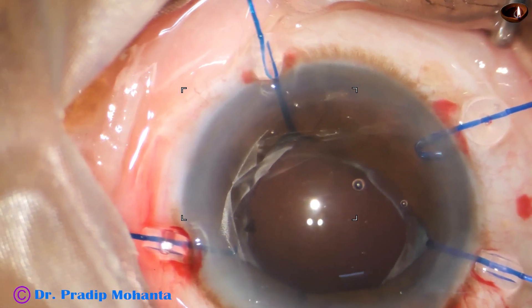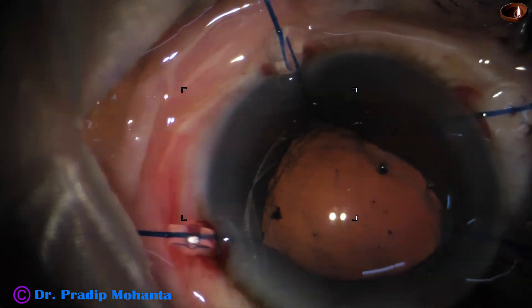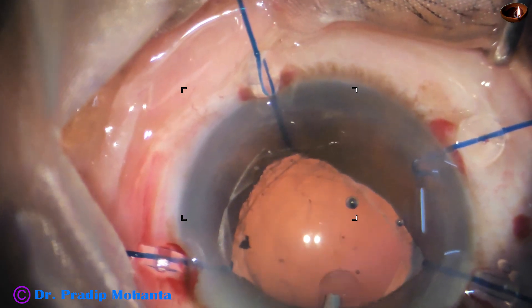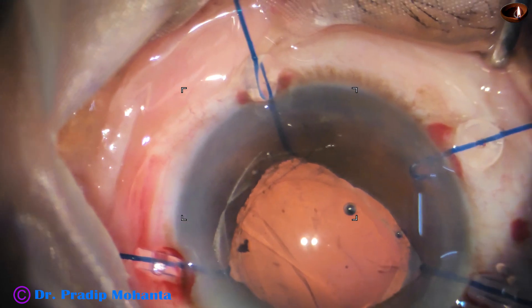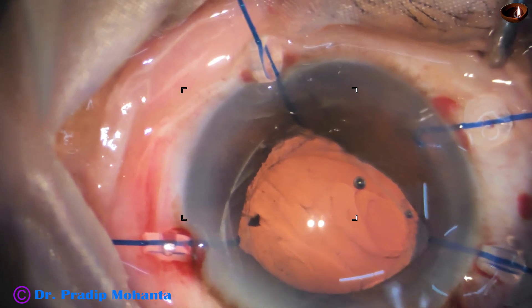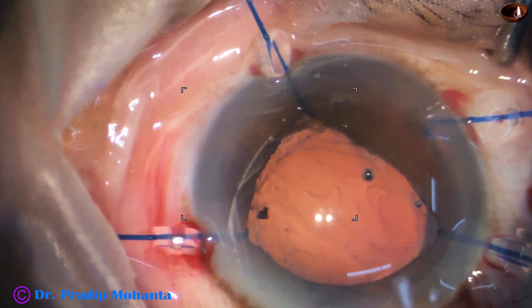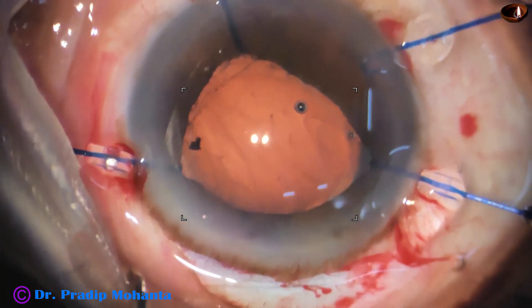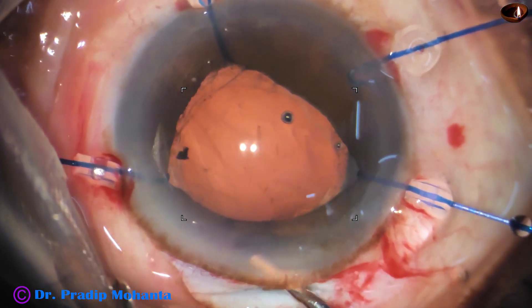Friends, we should not do a lot of maneuvers in the anterior chamber to cut the lens — you will definitely touch the corneal endothelium when you cut the lens. Better to make a 5.5 mm sclerocorneal tunnel and bring it out. Now I inject visco and I have a doubt that the posterior capsule is not intact, because with retroillumination of the microscope, I cannot see the capsule.